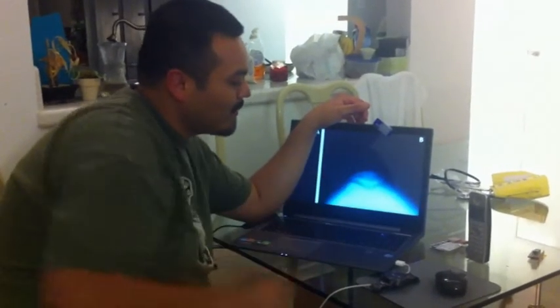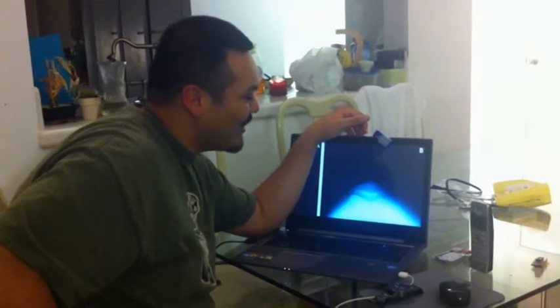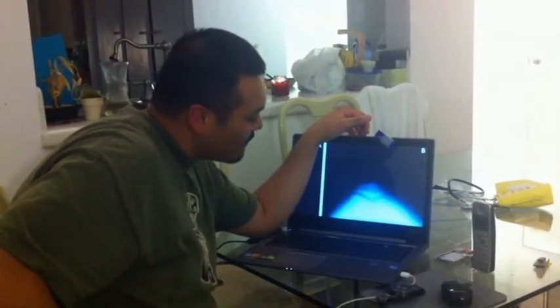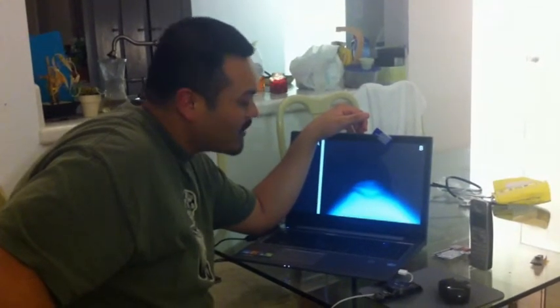You got your marker up here, up on the screen here, large left. So that right there looks good. Our contrast is good. Collimation was good, and I believe we got a good shot.